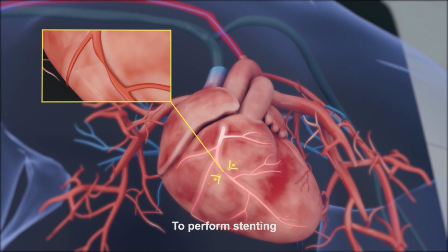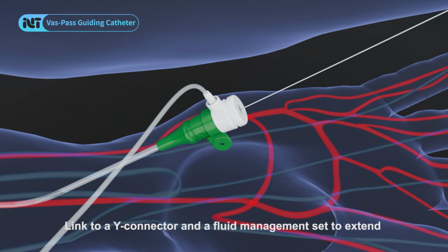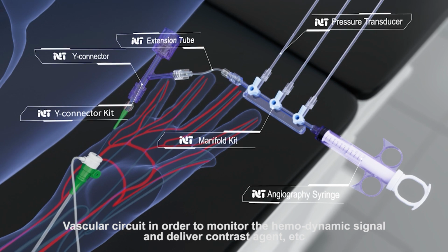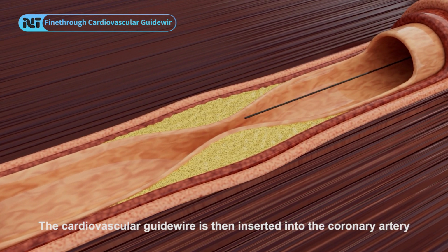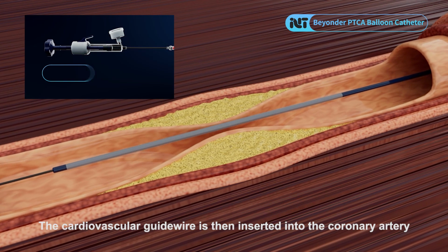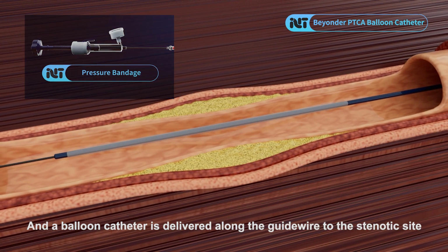To perform stenting, the angiography catheter is replaced with a guiding catheter linked to a Y connector and a fluid management set to extend the vascular circuit in order to monitor the hemodynamic signal and deliver contrast agents, etc. A cardiovascular guide wire is then inserted into the coronary artery and a balloon catheter is delivered along the guide wires to the stenotic site.